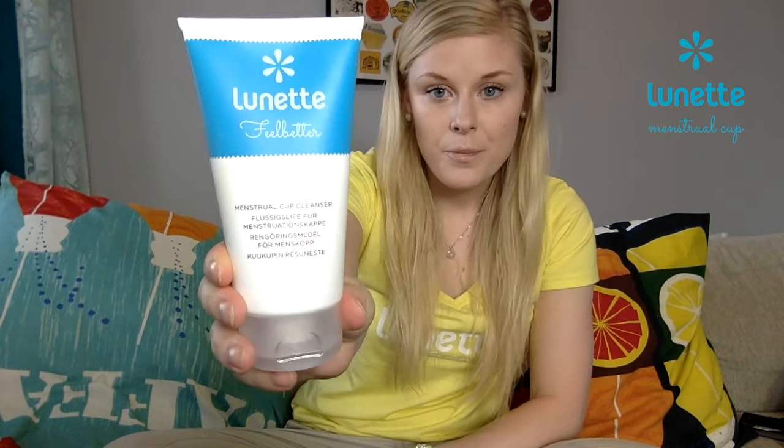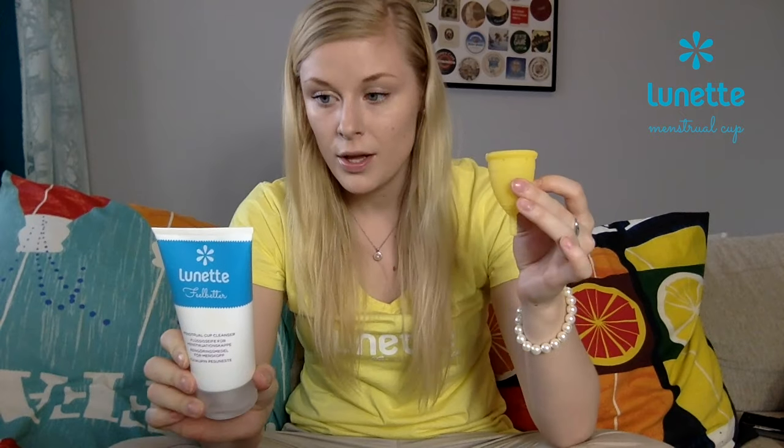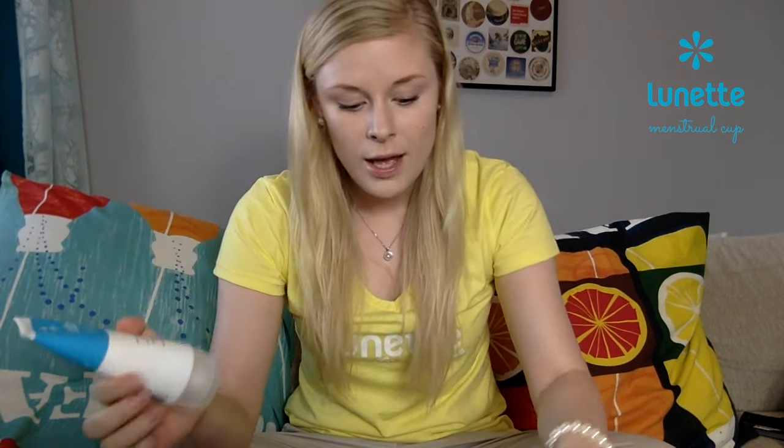During your period, I recommend you to use this one. This is because it's a perfect match for your cup — it's perfect for the silicone of the cup and for your body. The pH is just perfect for your vagina and won't harm you or the cup. And you don't need to use a lot — just a little tiny drop, wash inside properly and outside too. Rinse it and you're good to go.